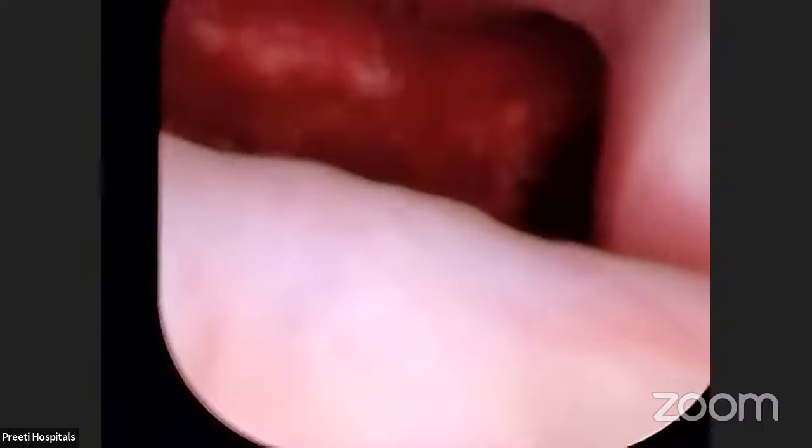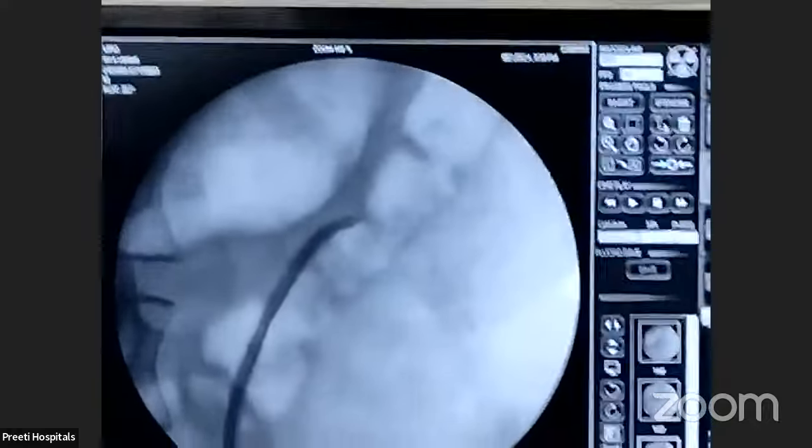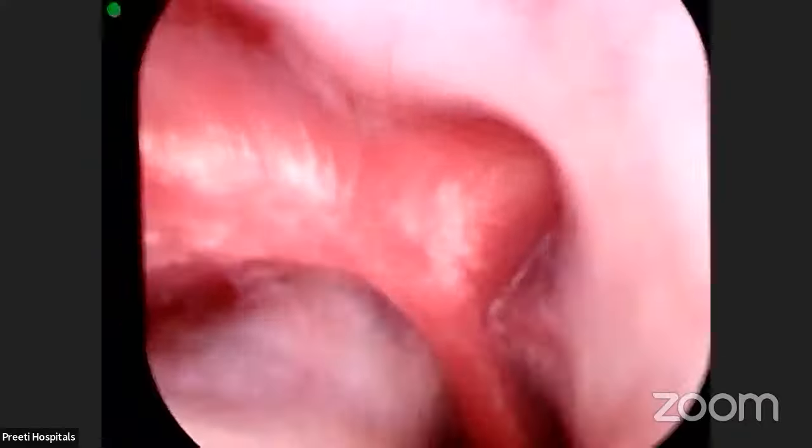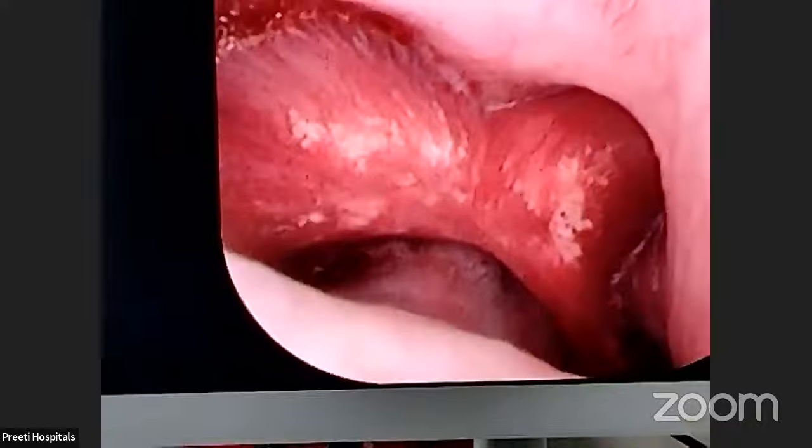This is emptied. Now this is the middle calyx. Pure middle calyx. Suck it out. Now see the lumen. See how it is sucking out. This is the inferior calyx. We will take out all this powder naturally. If by chance it doesn't come out, see how I am flexing. Now my flexible sheath, will it go into this calyx? Let us see. Push. See, he is pushing and the scope has come here. What else do you want? Everything is clear, all the calyces.